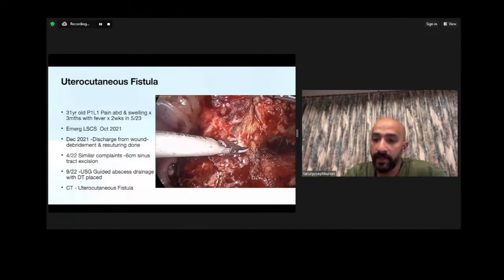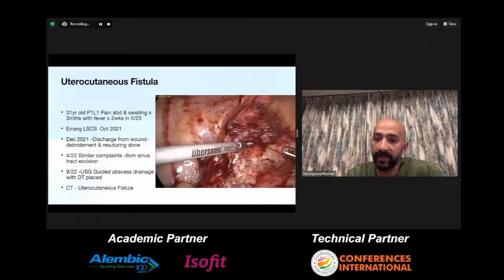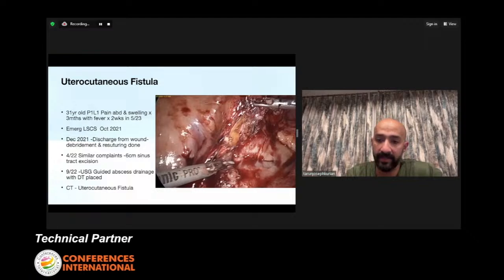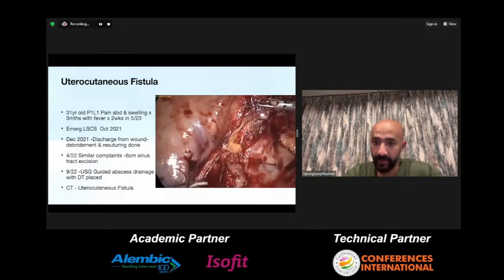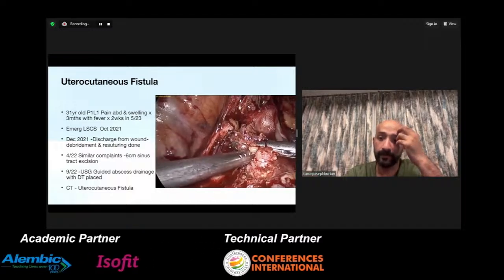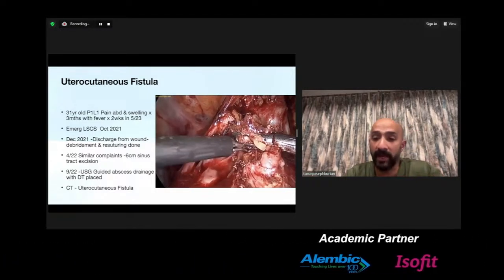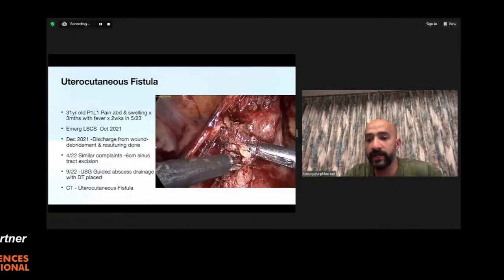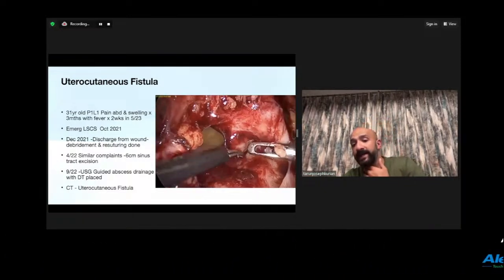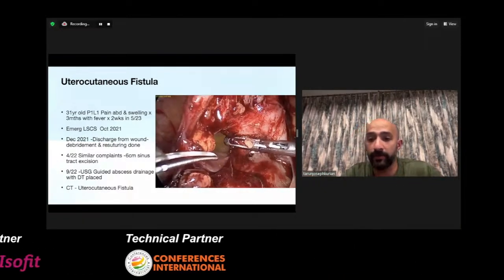proceed with the repair. So once I've taken enough of the tissue outside, I went back again hysteroscopically to try to see where the defect is. That's me just dissecting off the entire bladder. I went for sharp, not an energy source, cold scissors to make sure that I didn't damage. This is a point again, I thought I had entered the bladder, but it was just a peritoneal pouch again.